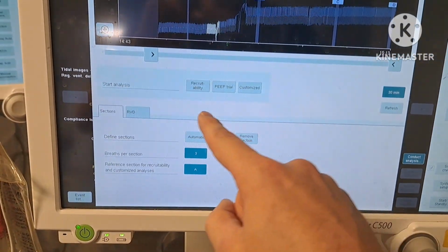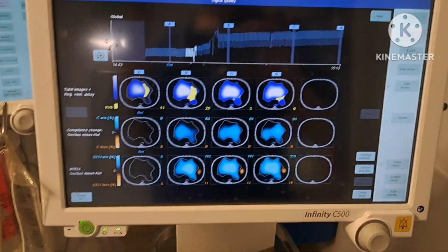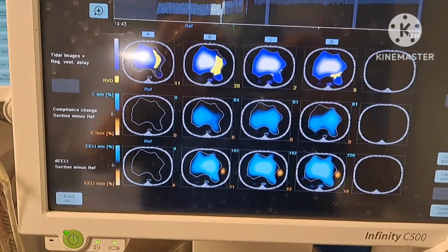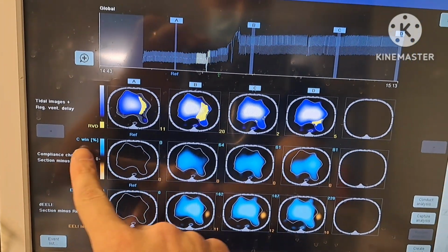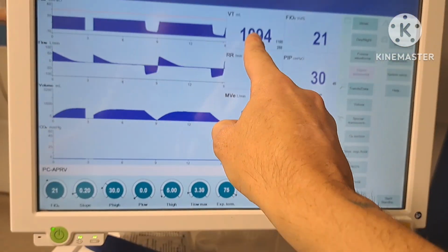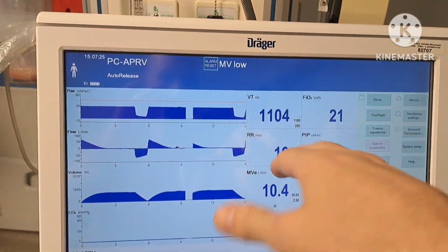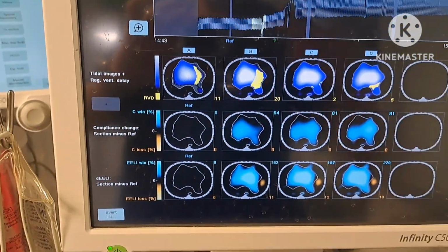Then after, we can also test it this way. I didn't touch anything. And then over here, it's showing compliance win, compliance loss. We only have compliance wins, okay? 0 compliance loss. With that, understand that this isn't just blindly allowing this release. Everything is being evaluated and everything is optimal here.